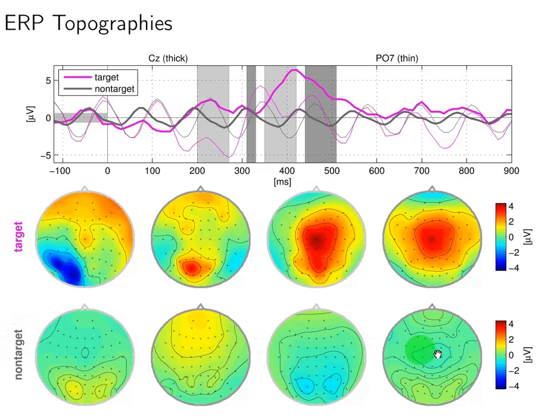One thing to note is that non-target has a very similar spatial-temporal distribution throughout, and it doesn't look like things are happening. For target, around 400 milliseconds we see a strong ERP or P300 waveform, represented as red color, which is very different from the non-target. We usually use these features as input to a classifier for building a binary BCI.